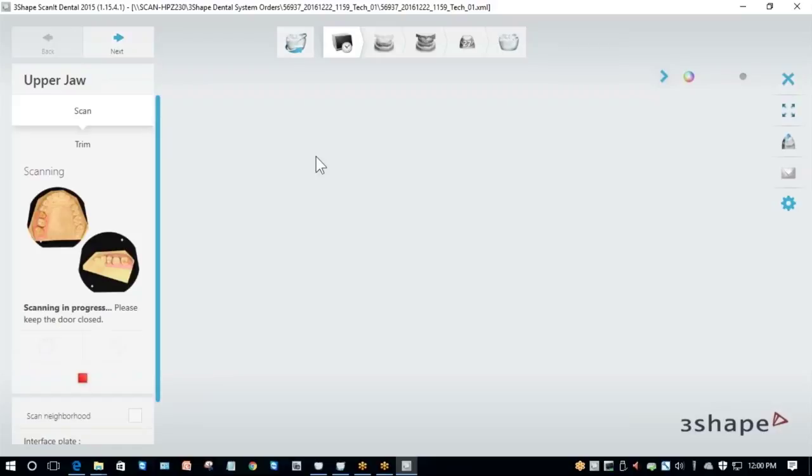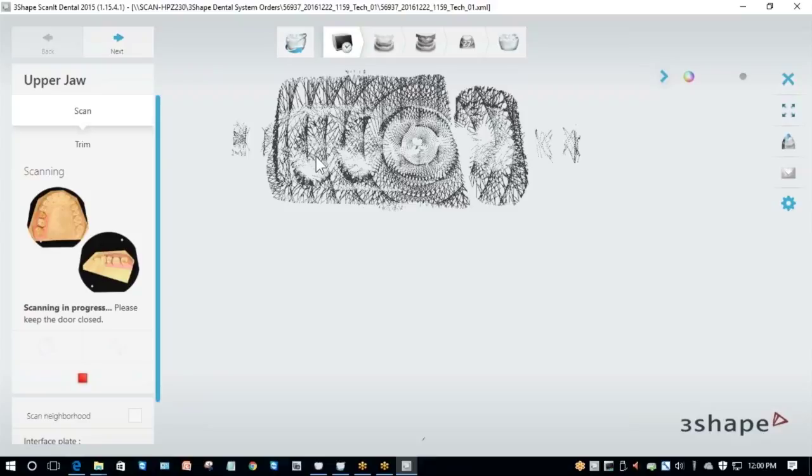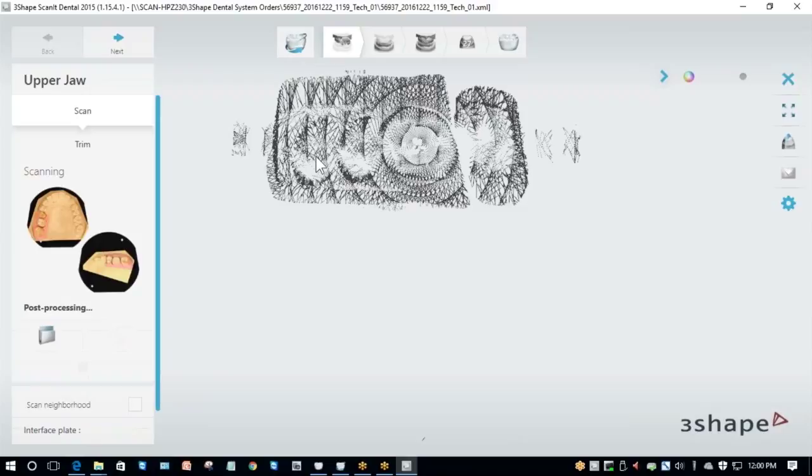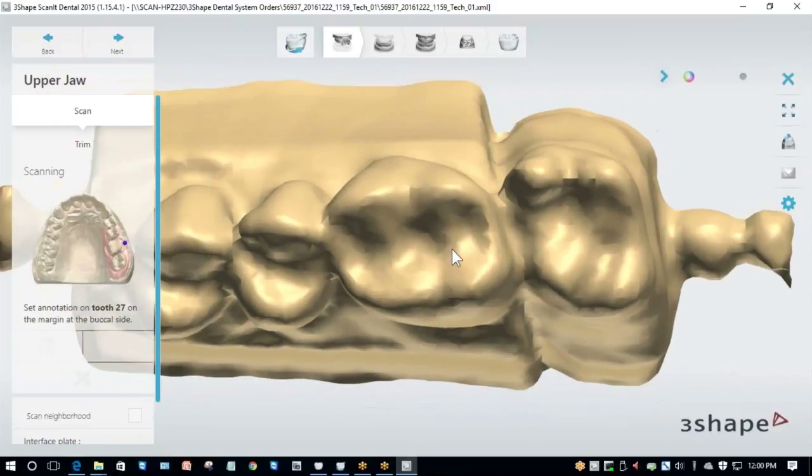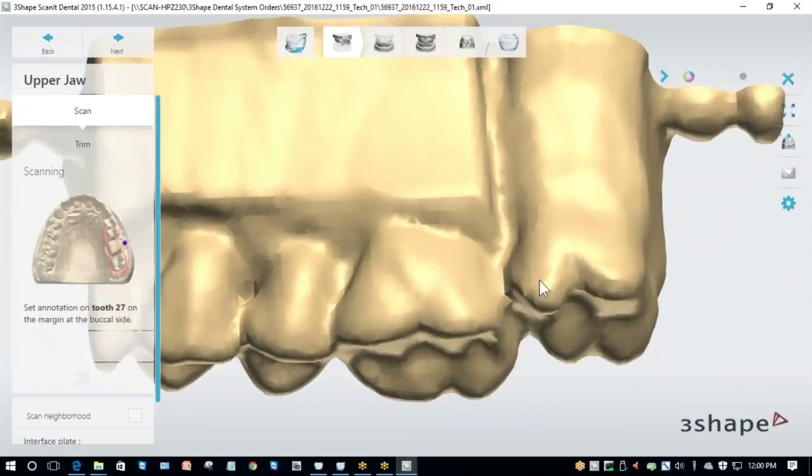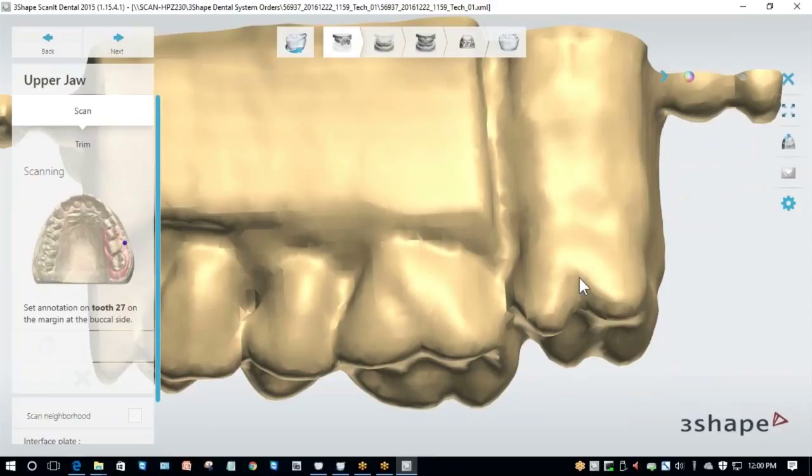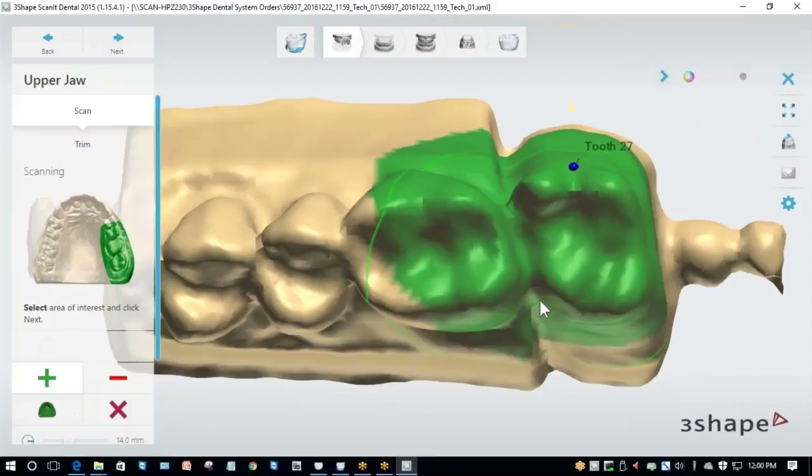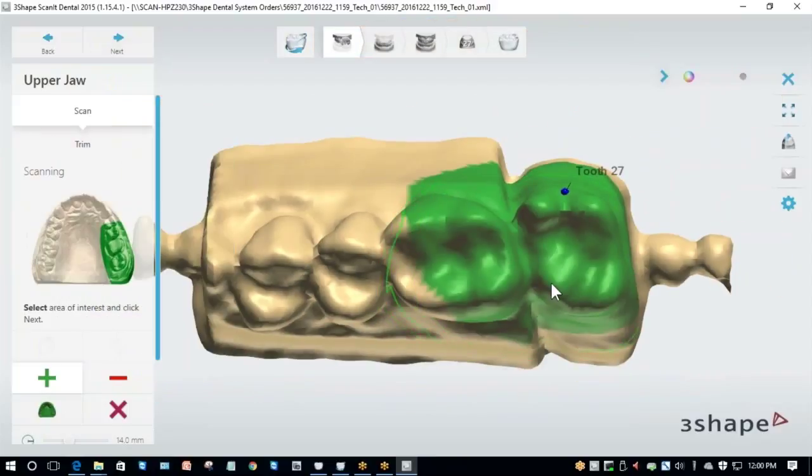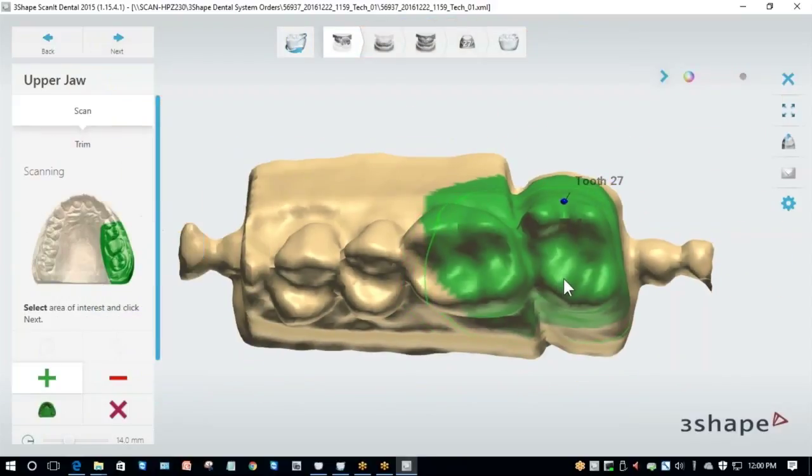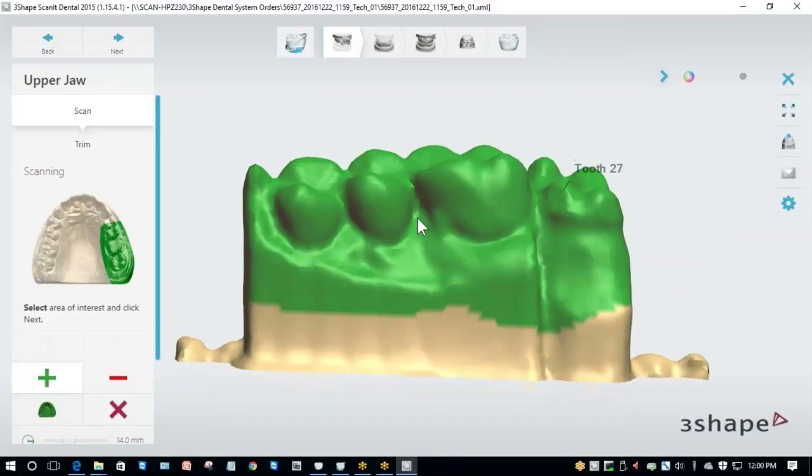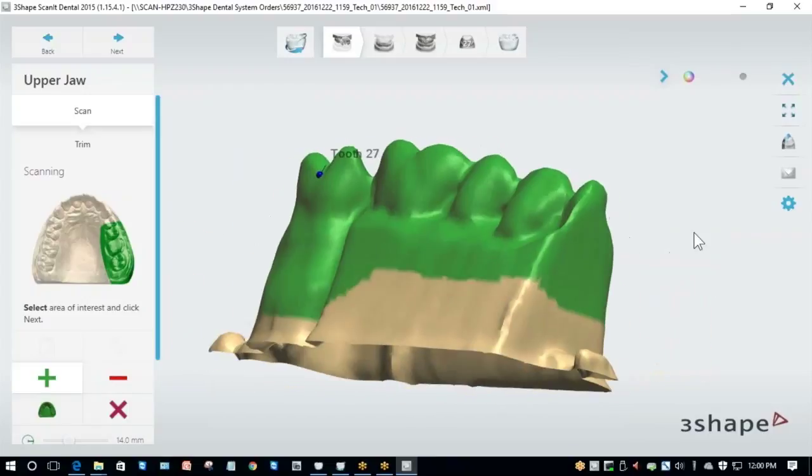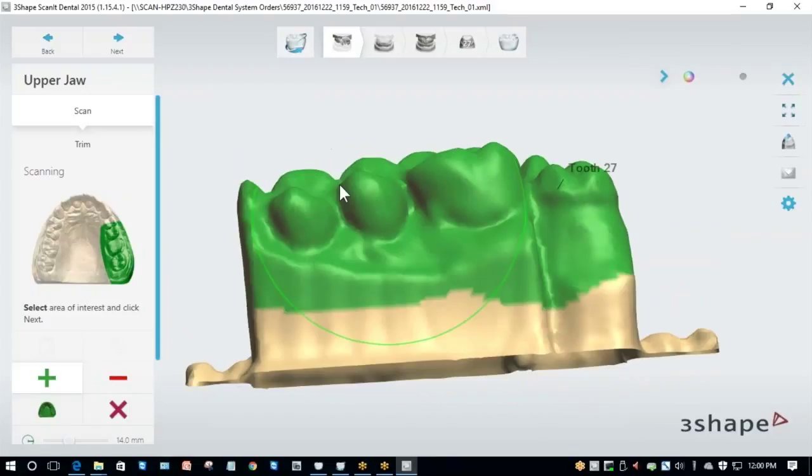The first scan it does is a Preview Scan. This is a quick and dirty scan, not your final restoration. It's simply a way for you to select the area you want to proceed with. What I'm going to do first is click on the buccal margin of the tooth, and after I've done that, I'm going to highlight everything else. Now that I've highlighted the model, I click Next and it does the actual scan.